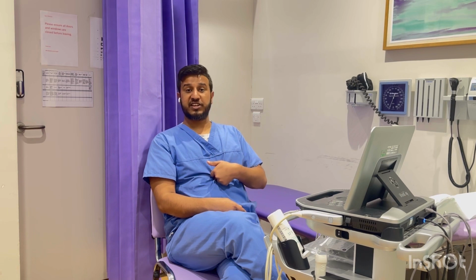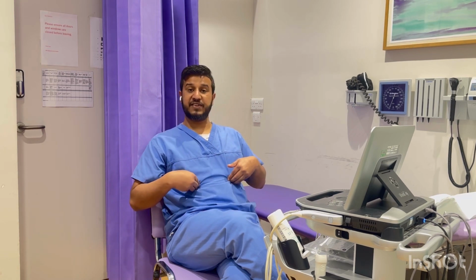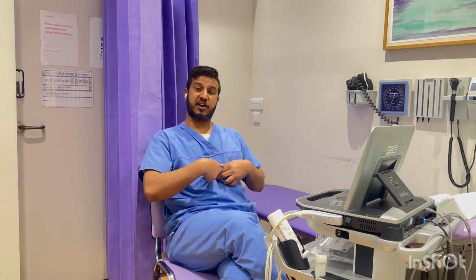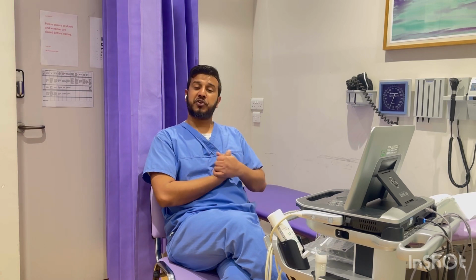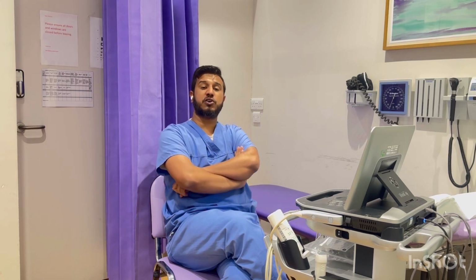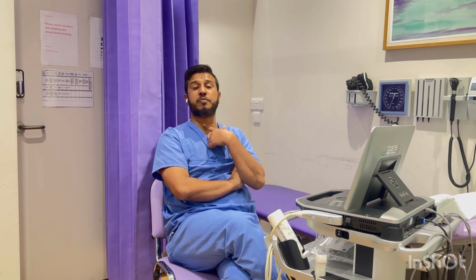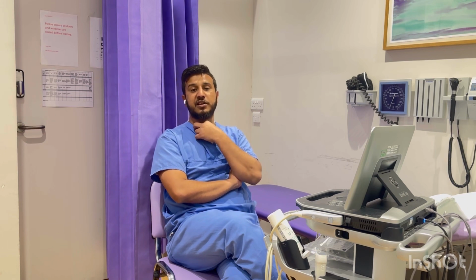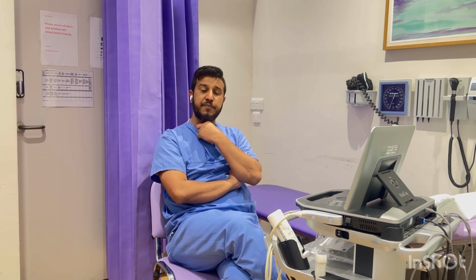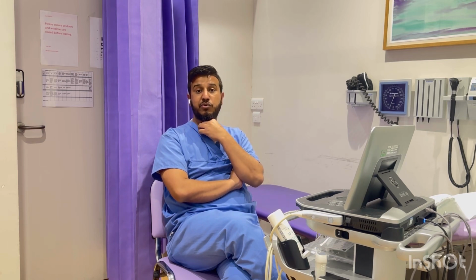Then you go into the xiphoid area or the subcostal area, where your rib area finishes, or your thoracic cavity finishes, and the abdominal cavity starts. Just at the end of the sternum, you put your probe there and you get the images from there. This is called subcostal images or subcostal windows. And the next one is the suprasternal notch. You get the images from this suprasternal area and you call them suprasternal images or suprasternal notch images. So these are the main windows from where you are going to get the images.